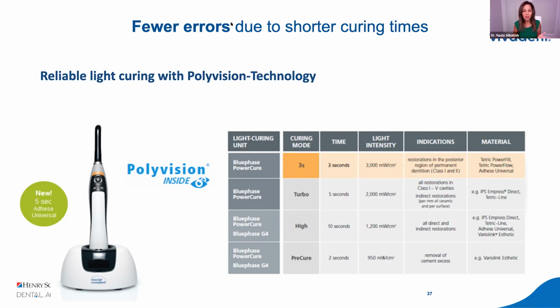These are the things I tell my assistant, and these are bright professionals. So if you communicate these things to them, your team can cure just as well as you can. But it's important for you to know this too up front and be able to communicate it. The cool thing about this light, if the assistant or you is holding the light over the tooth and your hand drifts, which I know we've all seen as clinicians, especially in the posterior, especially if they can't see very well, right? Especially if they're at the very back of the mouth or they're doing an upper tooth.